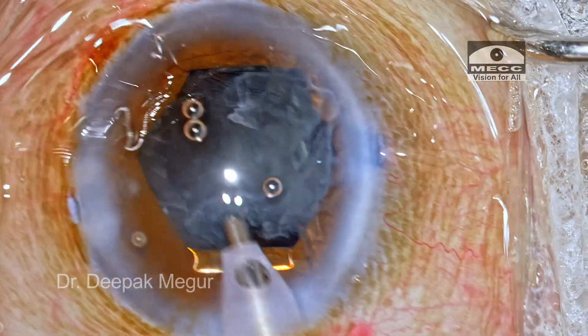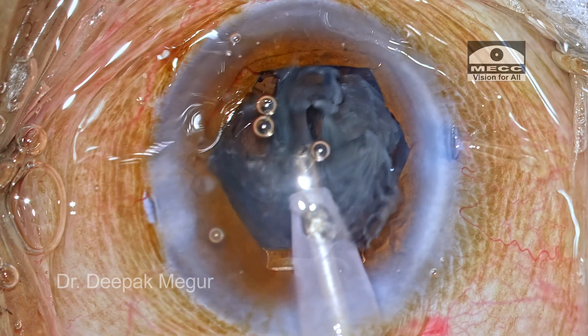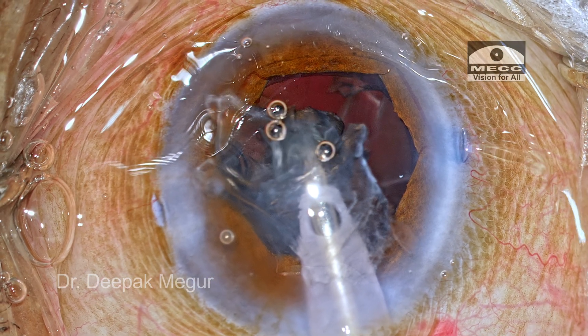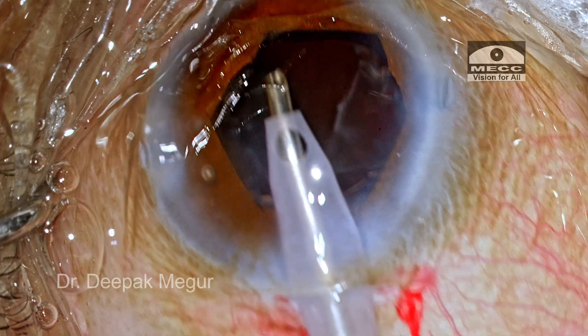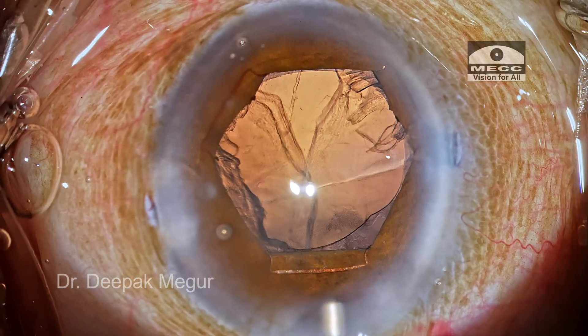Why use phaco again for the epinucleus? Simply because this epinucleus cannot be aspirated through the smaller bore of the I&A handpiece. We need to switch back to the phaco tip, and then it's aspirated in a jiffy. This is a useful tip for dealing with a sub-incisional epinucleus that refuses to be aspirated easily.